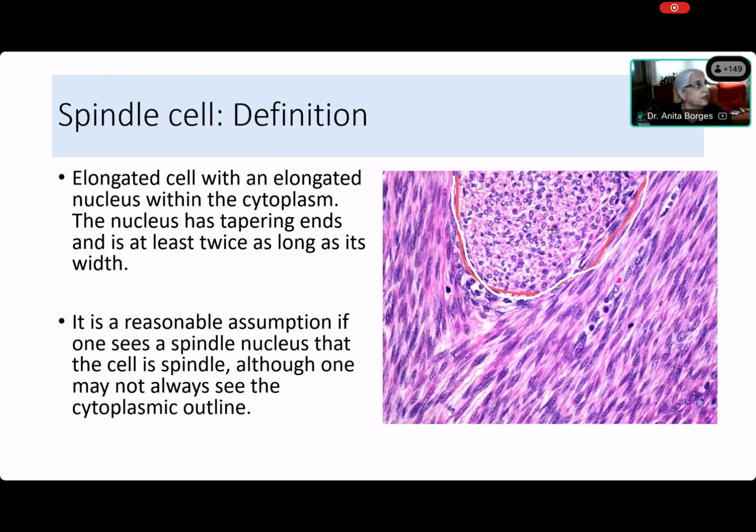Do you think that these cells that are within the area that I have demarcated are spindle cells or not? Come on, Aditi. Are these spindle cells or not? Okay, so we're going to take a poll now. Aditi says no, ma'am. Shashank says no. Kedar? No. Chandana? No. Very good. Priyambada? Yes, ma'am. These are spindle cells.